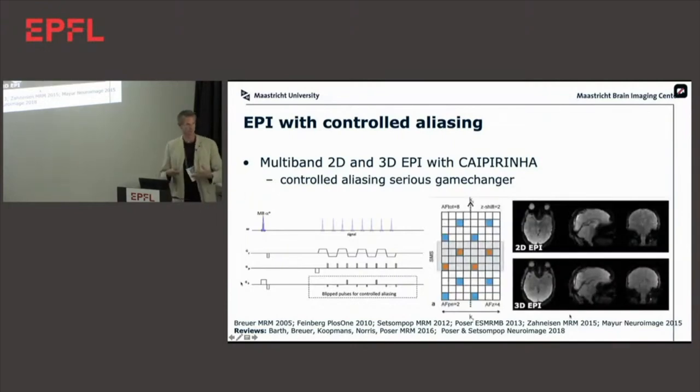If you look at it as a Philips person, if you look at it from a SENSE perspective, you go like, yeah, duh, that's obvious. But I think in the Philips, in the Siemens world, that wasn't embraced so quickly. I would love to share some interesting review comments here we had on that paper. They were quite kind of disturbing. But anyway, it's fundamentally the same thing. With multiband 2D, you're sampling the same thing as you do in any 3D sequence. You construct it the same way too, if you like. Anyway, that's not how they chose to do it for the 2D. I mean, for the 2D, they reconstruct slightly differently.